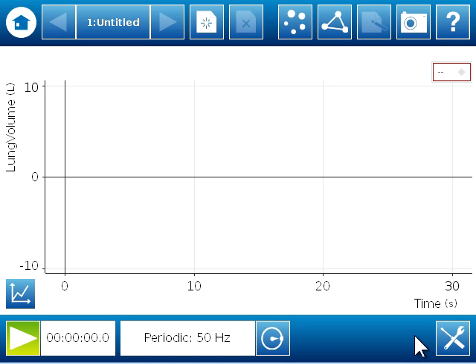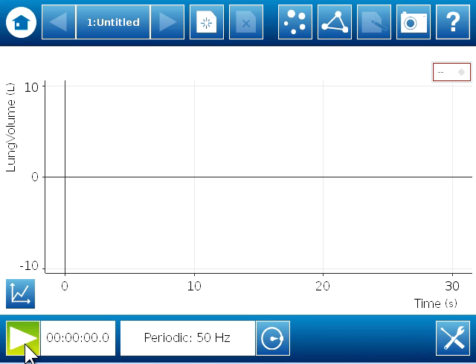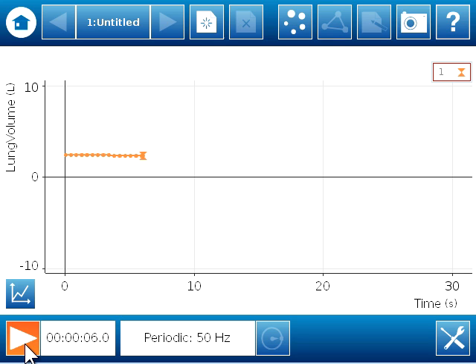So now I'm going to go ahead and collect some spirometer data. The directions for the spirometer use tell you to begin data collection with the spirometer mouthpiece resting on the table. So I'm going to do that right now. It's just at rest on the table. And there are two lights on the spirometer sensor. Initially, the red light will blink and it says wait.